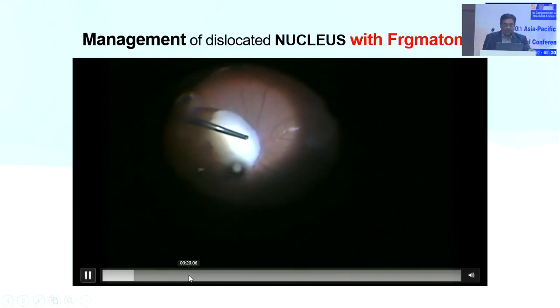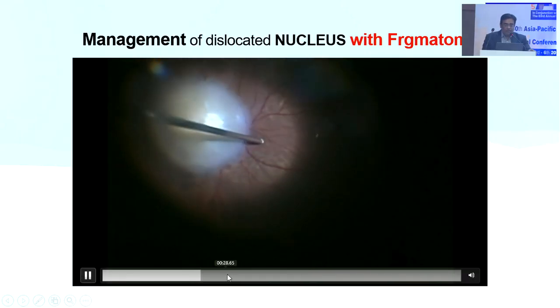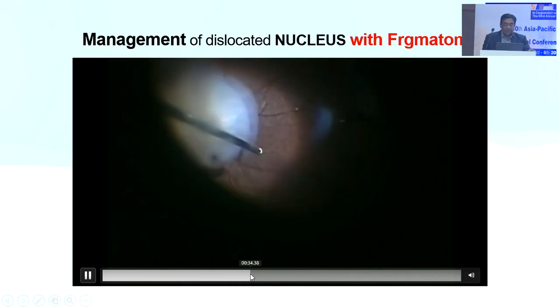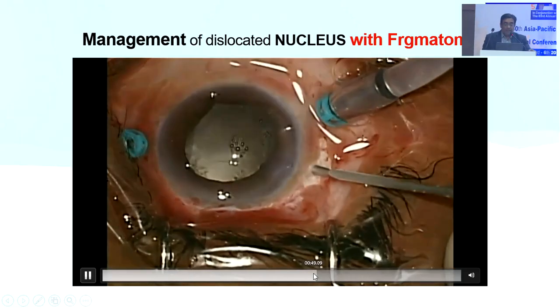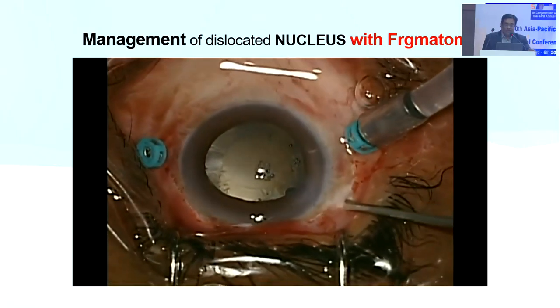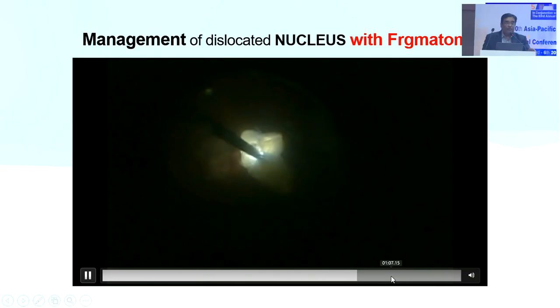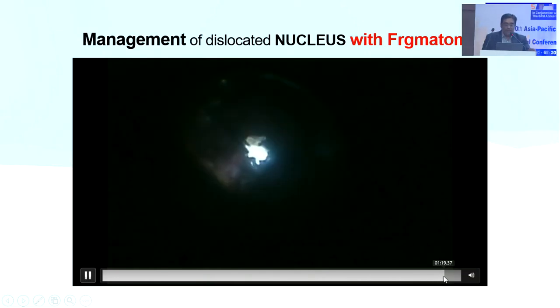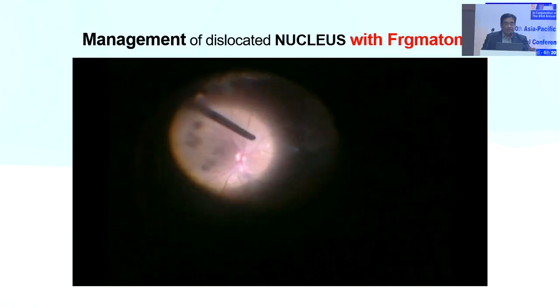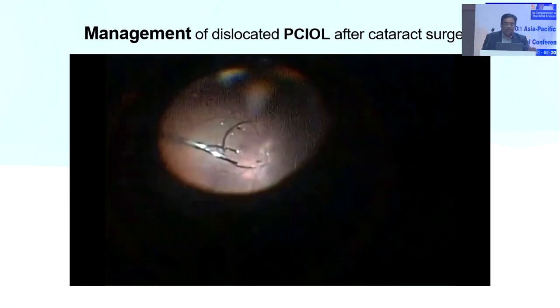After complete vitreous removal and release of all the tractions, do PVD so that you can use PFCL. After that, enlarge the sclerotomy with the MVR blade for the fragmatome, and then use the fragmatome for the removal of the hard nucleus. After completion of the vitrectomy, you can plan your IOL depending on the anterior capsule status. It is the same for an IOL drop also.